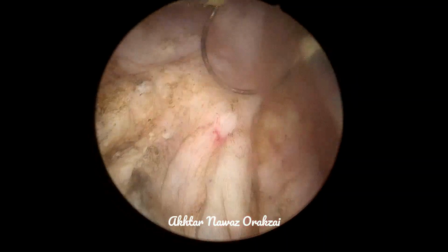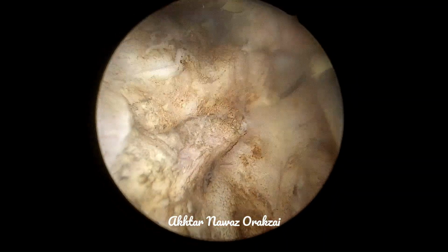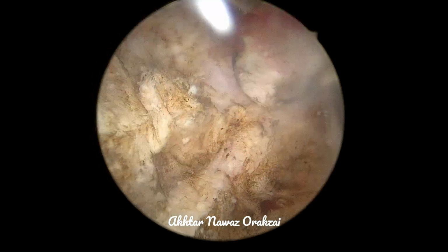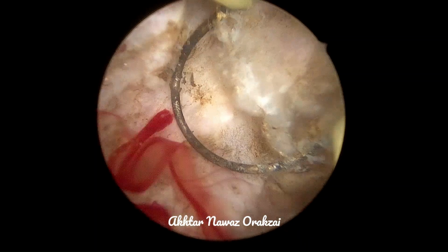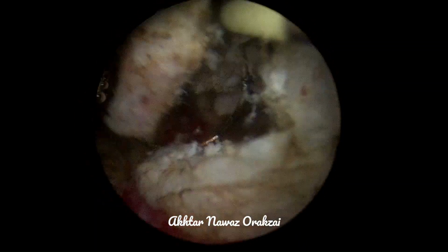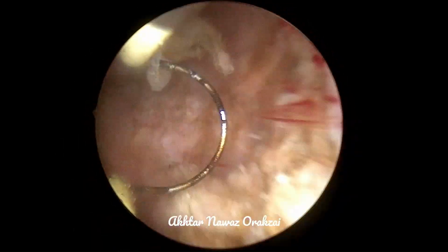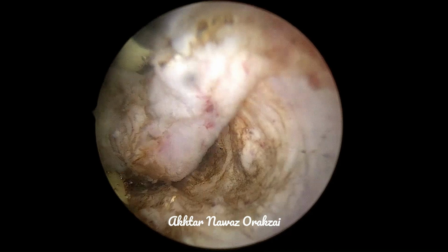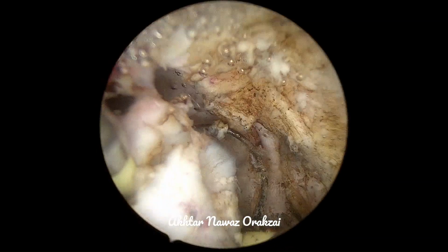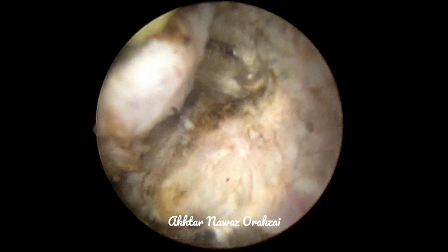A capsule breach in the lateral lobes is not as significant as in the anterior and the posterior lobes, because a breach of the capsule of the anterior lobe will lead to bleeding from the venous plexuses of the prostate, which can be life-threatening. And on the posterior side, a breach in the capsule may cause injury to the rectum.